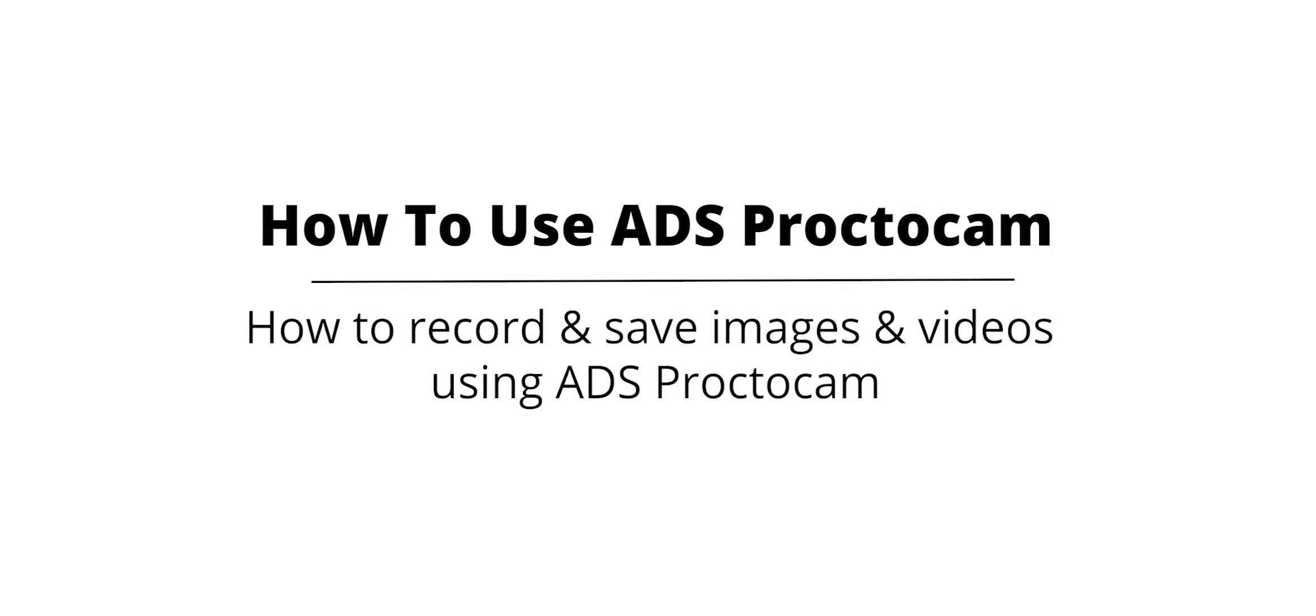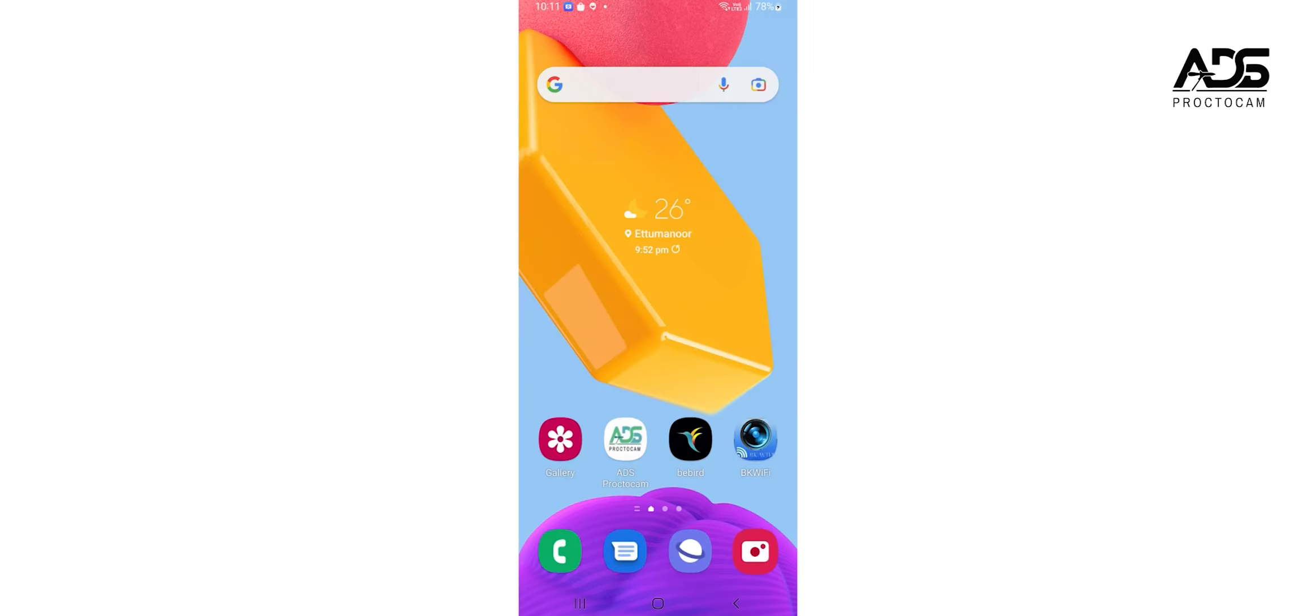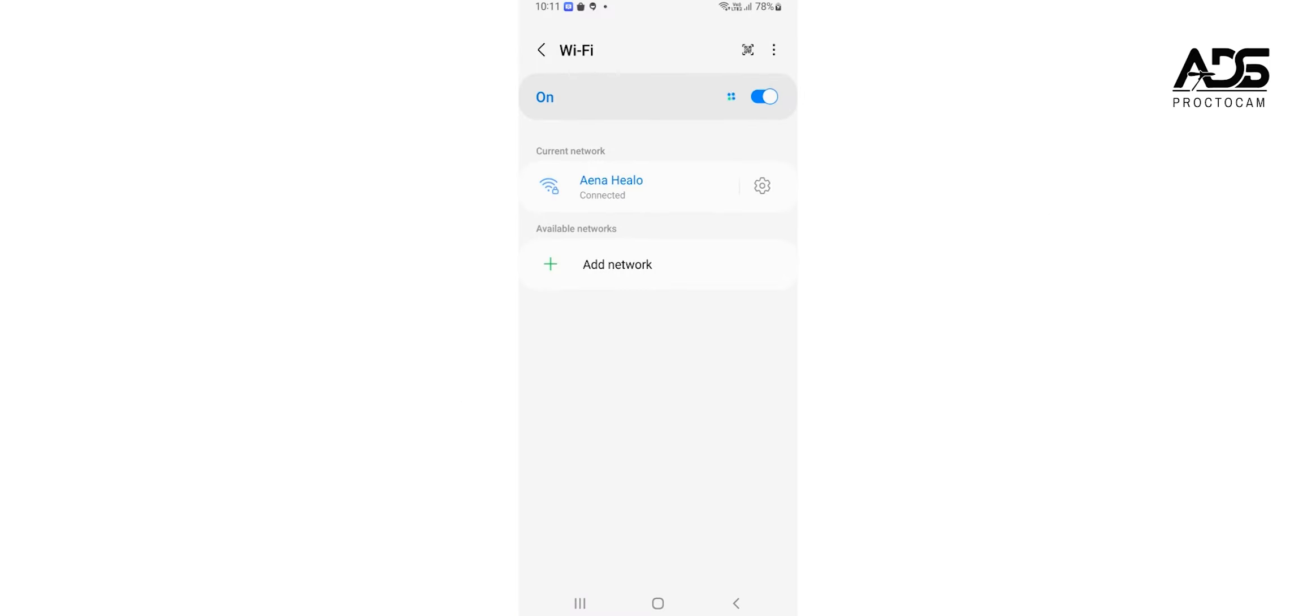How to record and save images and videos using ADS Procticum. Make sure you are connected to ADS Procticum over the Wi-Fi.